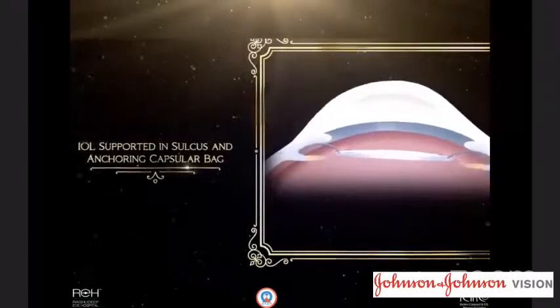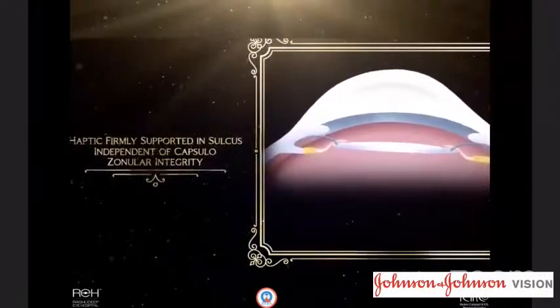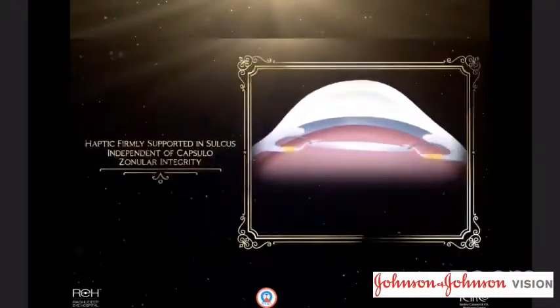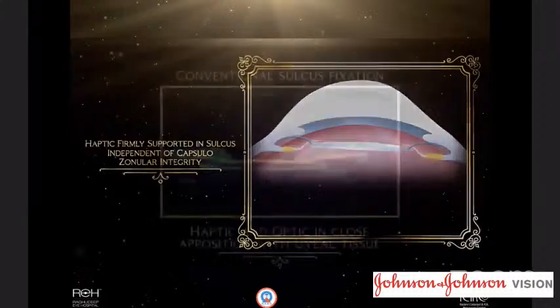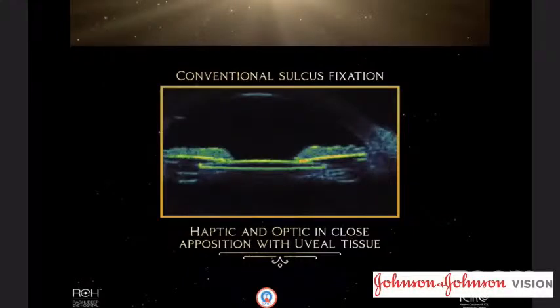But the best part is that here the IOL and capsular bag complex is actually supported by the haptics in the ciliary sulcus. So you don't need to depend on the loose capsular bag zonule complex. This is different than putting the entire three-piece lens in the sulcus, which is a conventional way of doing it. And we have done many. We repeated it several times by putting single-piece AcrySof and many others.